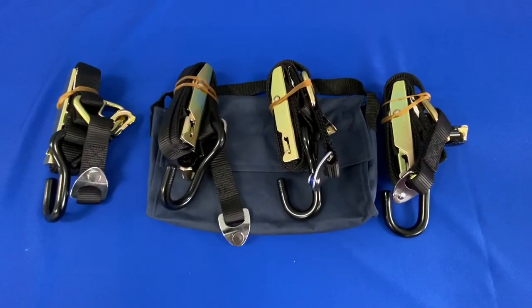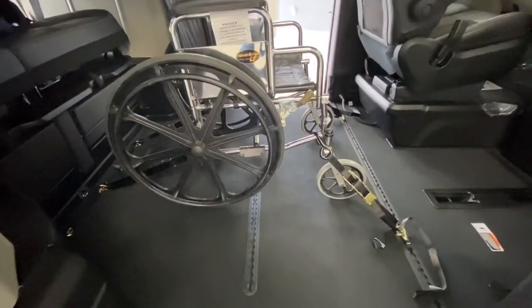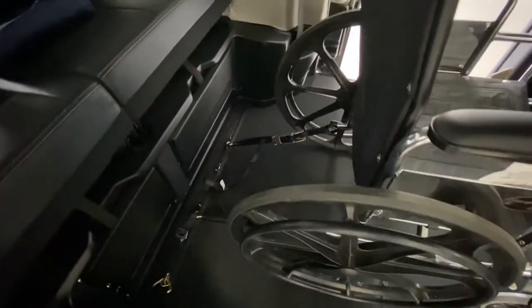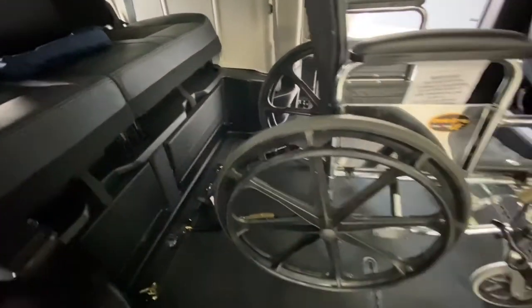Hello from Superior Van and Mobility. Today we're going to go over the manual wheelchair tie-downs that come with every wheelchair accessible vehicle and conversion van that we sell. Keep in mind that all wheelchairs and power chairs are made differently. This video is just used as an example to show you how to operate the manual tie-downs.